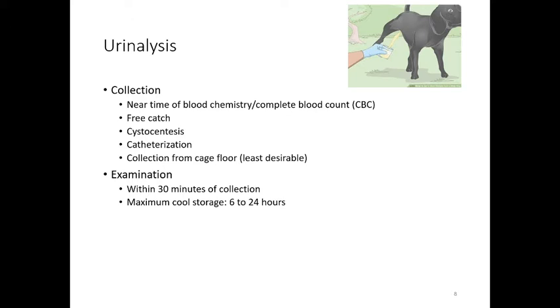If we have a little bit of blood in there, that could be because we had a needle sticking into the bladder, which can cause a little bit of bleeding. So a few red blood cells don't necessarily tell us anything. But a cystocentesis is useful for a couple of different reasons. We don't have contamination, and we can culture it to see if we do see bacteria. We can see what kind of bacteria there is.